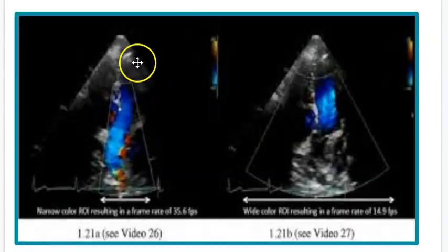And this was a demonstration we put up on the board. This one here is hard to see, but this color box is covering our LVOT, showing blood coming out the LVOT, and we're getting a really nice smooth flow there. There's virtually no change in velocity of the blood right there. It's all blue on the way out. You can see it lights up a little bit as it goes through the aortic valve. That's typical, where it's going to increase in velocity as it goes through that orifice.